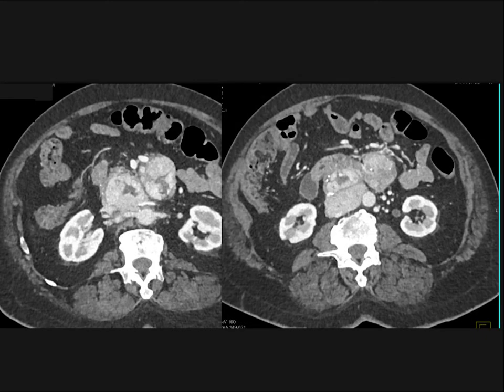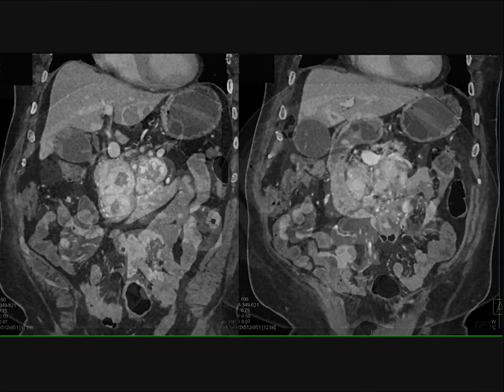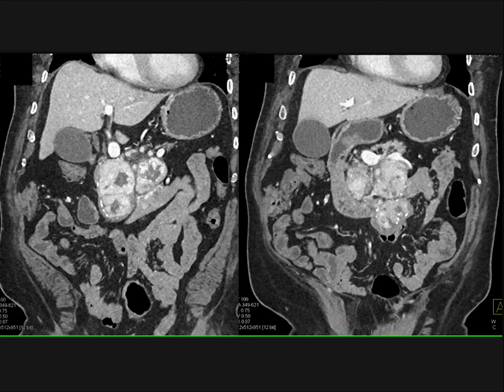You can see even on venous phase imaging near the SMV, SMA, large, bulky necrotic nodes pushing on the IVC. You can see it here again in the coronal perspective. So it's a really unusual example. I don't think you'd have a problem recognizing what tumor you're dealing with or where the tumor is, but you might even consider renal cell with vascular nodes. There's a lot of things you would consider, but unless you focus on the abnormality of the duodenum, you're going to get the wrong answer.